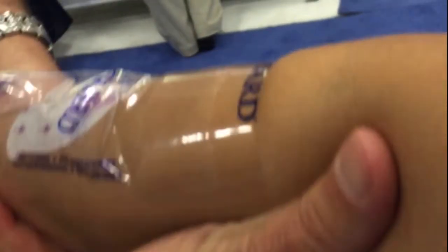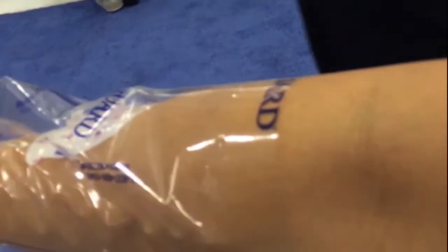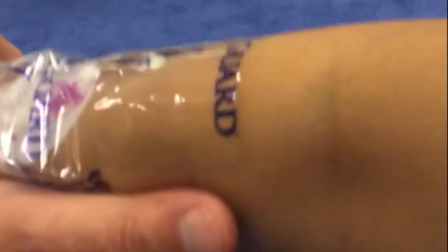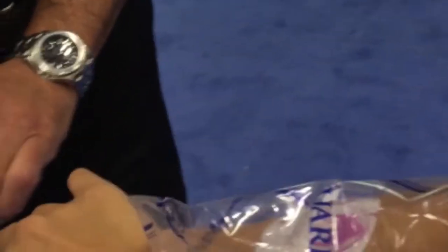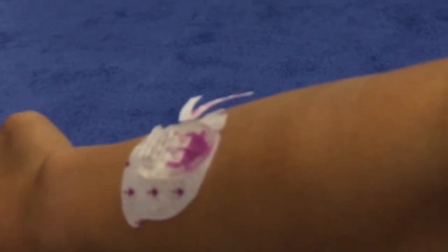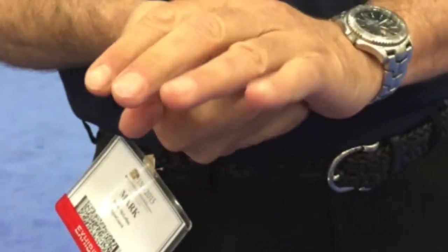What are the success rates — have you guys done any research or literature on these? If applied correctly, it doesn't leak at all. And when you go to take it off, just discontinue it. That's a nice feel — the adhesive is strong enough to keep out water but it's not so aggressive as to damage or compromise the skin.